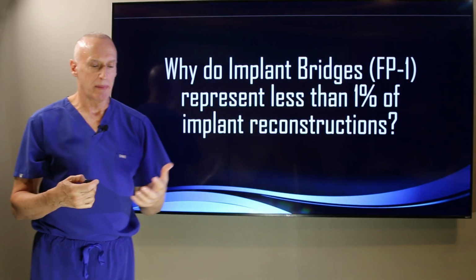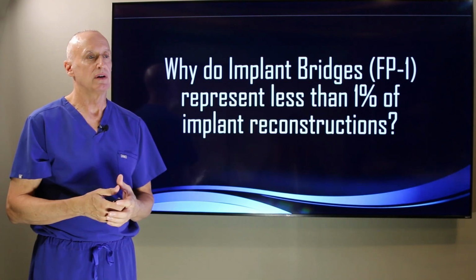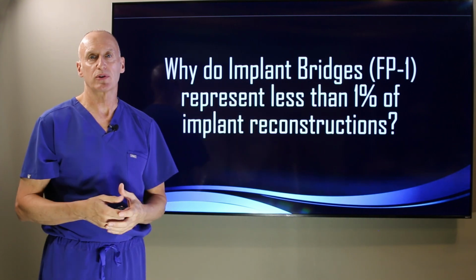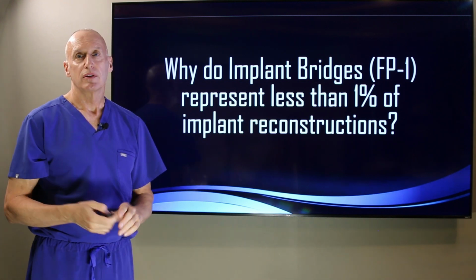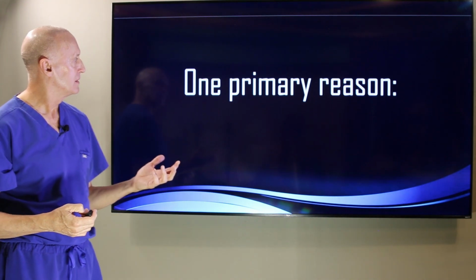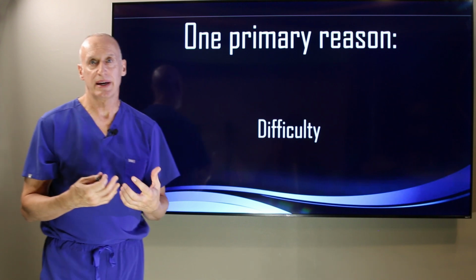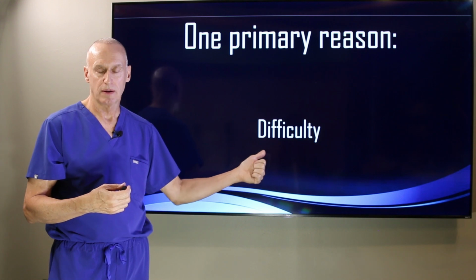So again, let's go back. This is a repeat of my last video. Why is it that implant bridges or FP1s only represent less than 1% of all the implant reconstructions out there? Well, there's several reasons. The first one is they're really difficult. We can only see one patient per day because of how much longer it takes me to do the surgery.